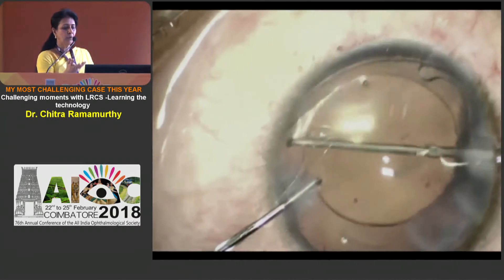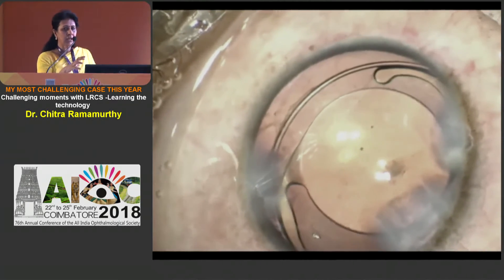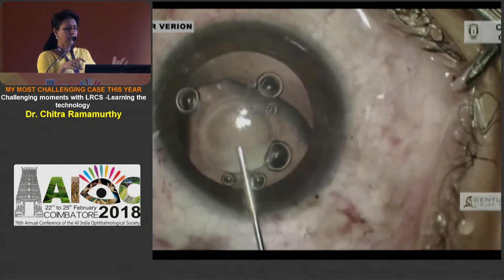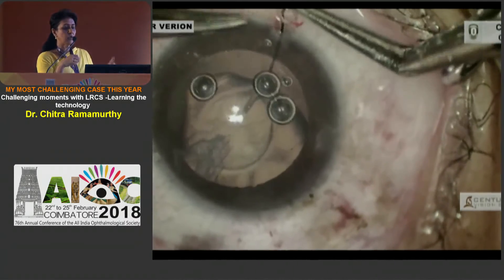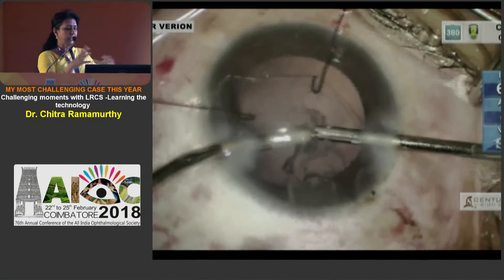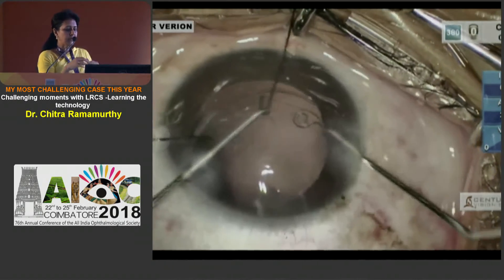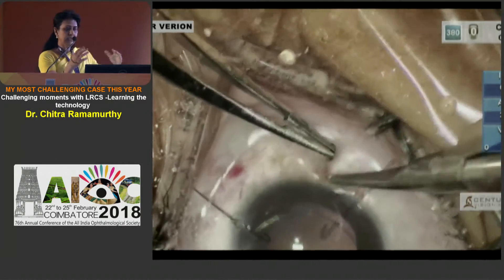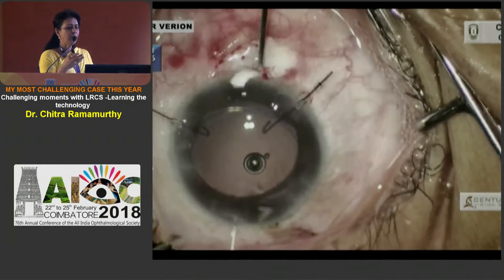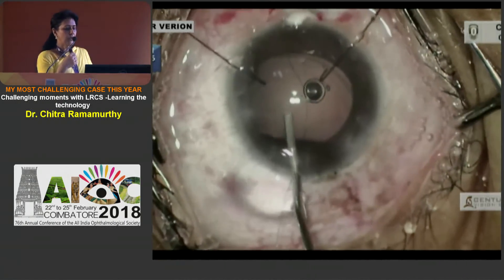This was a traumatic cataract. I did not expect progression of the zonular dehiscence to increase, so I go in and position the IOL such that the haptic further stretches. This was a very severe dehiscence. Again on the femtocataract platform I've created the rhexis, because it ensures the right size rhexis, which could be a great challenge when the cataract is subluxated and the capsule is lax. I place the capsule hook such that it keeps the capsular bag taut. Removal of the cortex has to be done gently, because if you pull on the capsule-zonule complex, the whole bag would collapse. I then position the CTR to support the bag, and then go in and create a small triangular flap. You need to ensure that for this kind of subluxation, you attach it to the scleral wall, so I do the usual railroading technique.